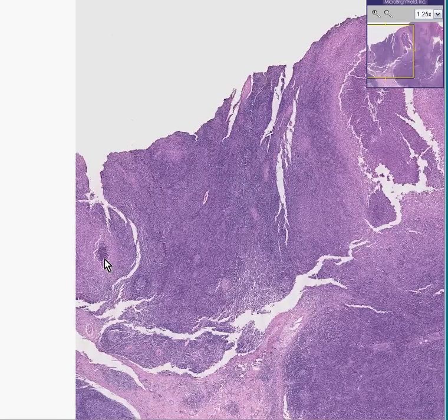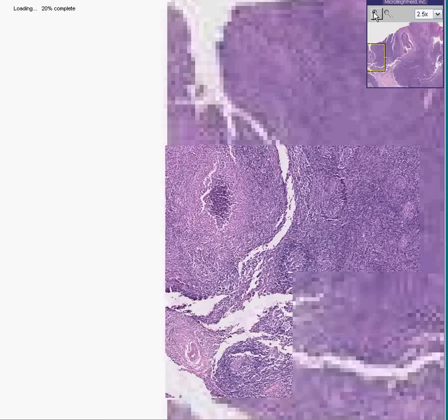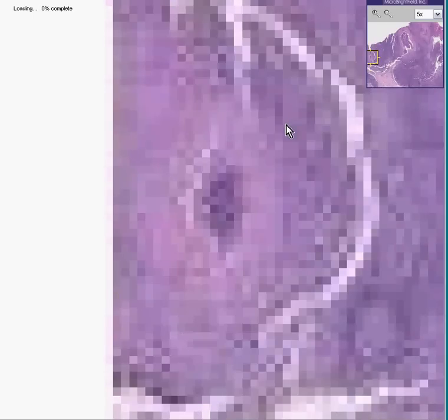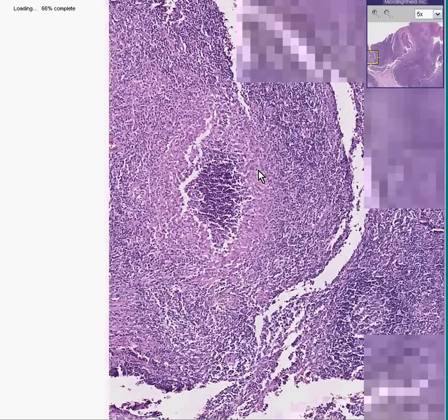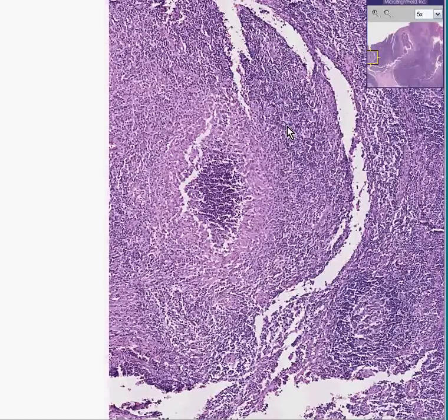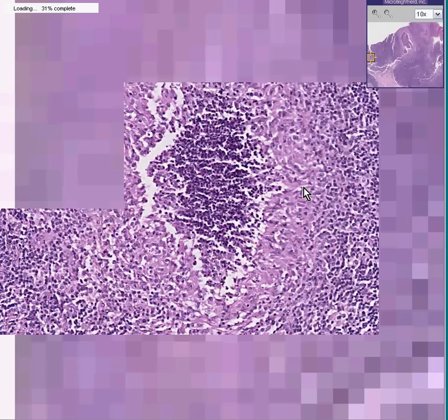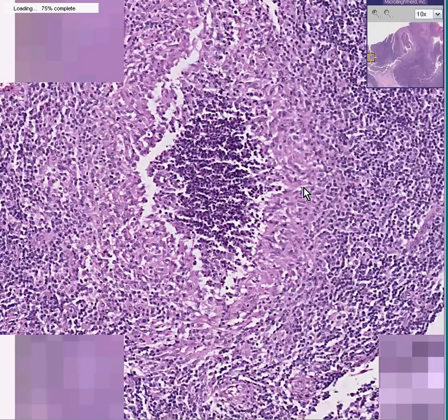Let's look at the smaller one first and zoom in on it. What you see in the smaller abnormality is that you have chiefly granular histiocytic-looking cells surrounding an area that is acutely necrotic, and underneath an area which looks like fairly mature lymphocytes. For all classical purposes, this is a granuloma — this is the classic definition of a granuloma.